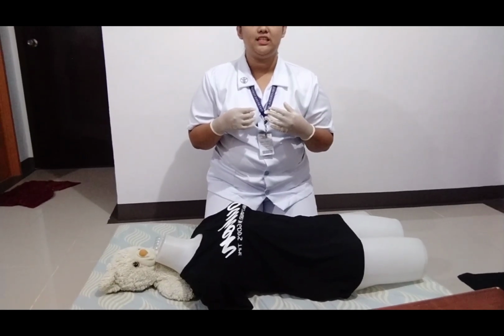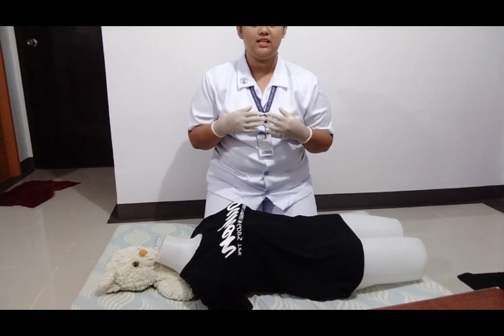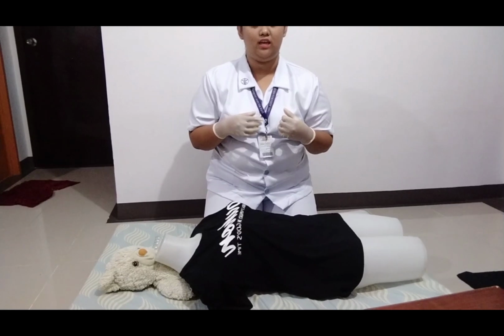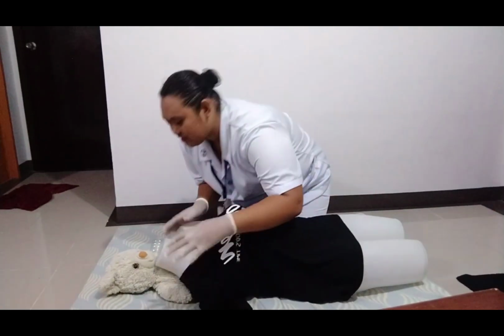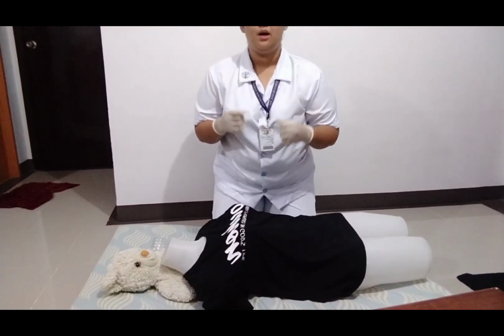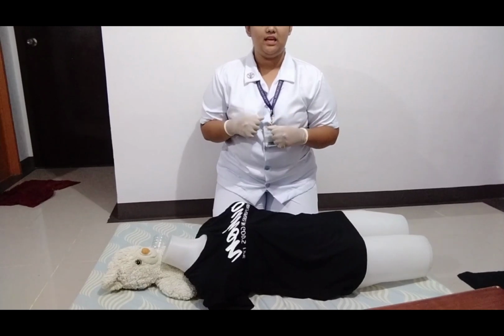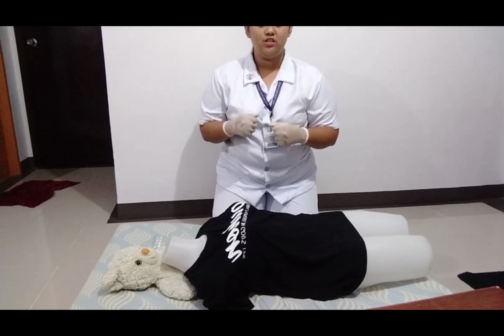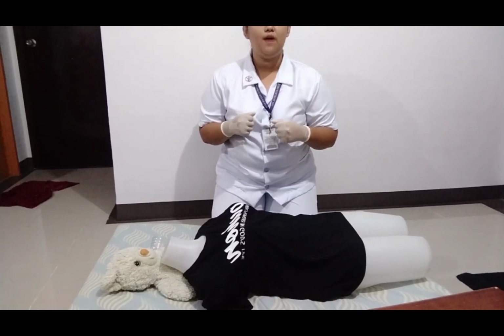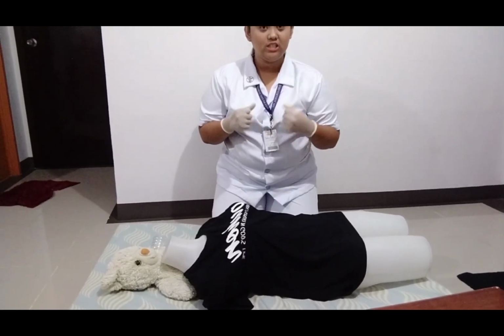Now, after ensuring the scene is safe, I am going to check the level of the victim's consciousness and responsiveness by tapping the patient's shoulder and asking if he is okay. Sir, are you okay, sir? Sir. While I'm doing that, I'm also assessing whether the patient is breathing normally, is in agonal respirations, or just not breathing at all. So now I see my patient has no movement, has no response, and is not breathing.